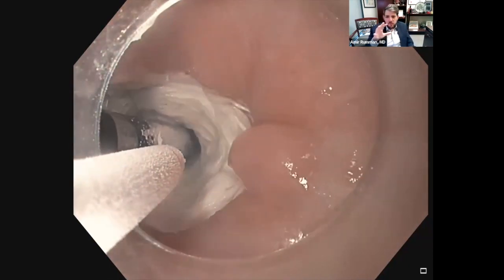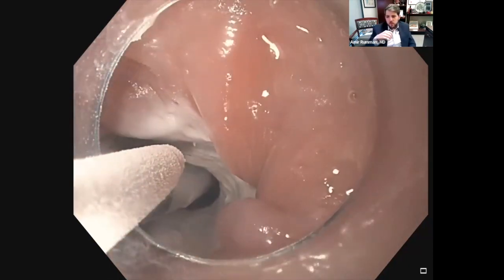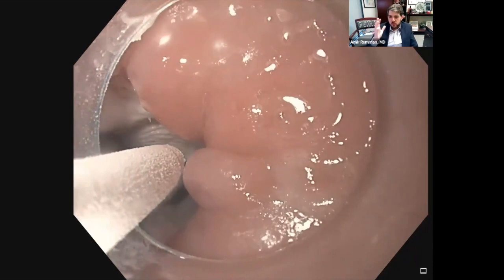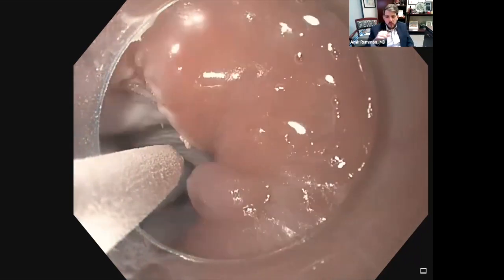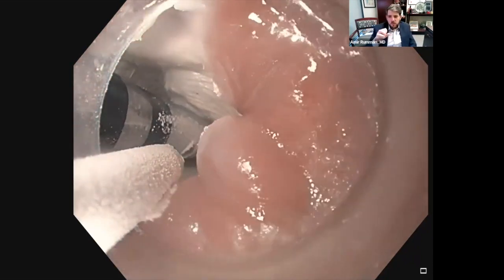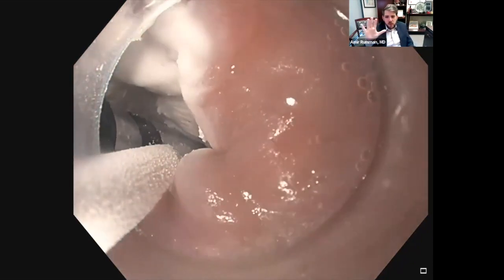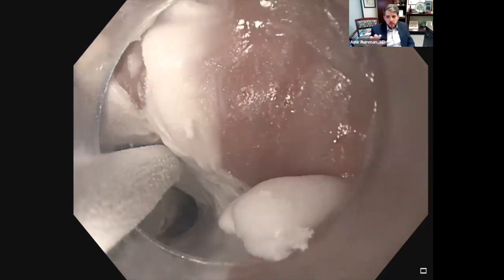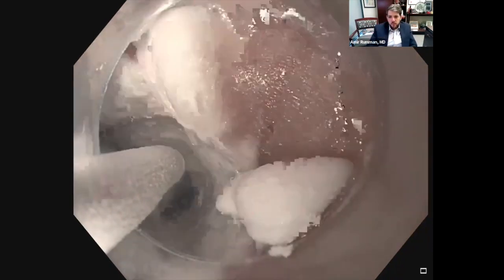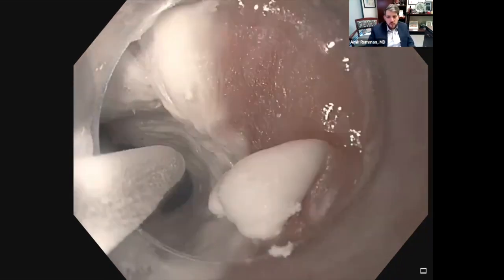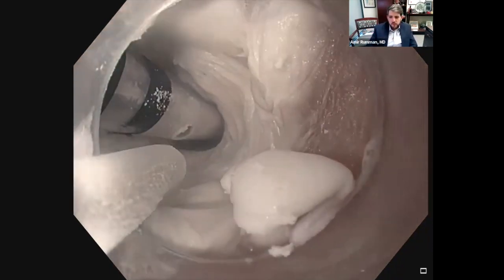Sometimes if you're working too close, you can freeze your lens and that really limits visualization. And we're going around the stricture trying to do a 360-degree freeze.